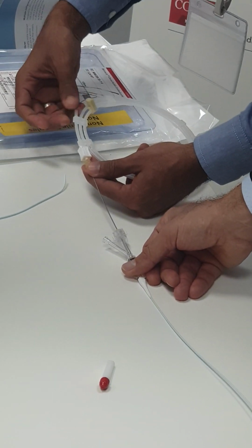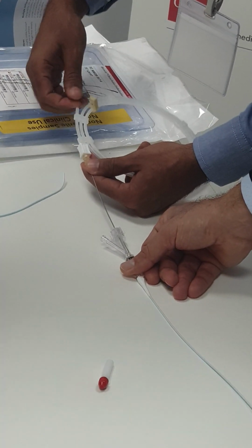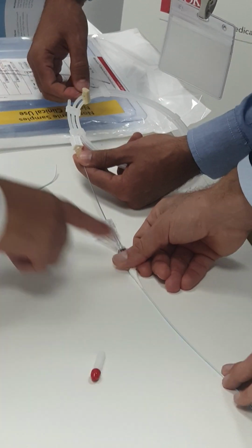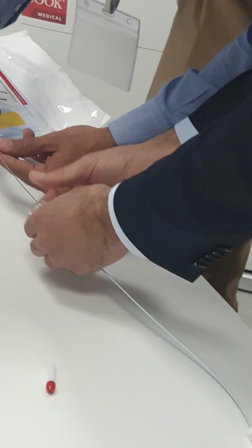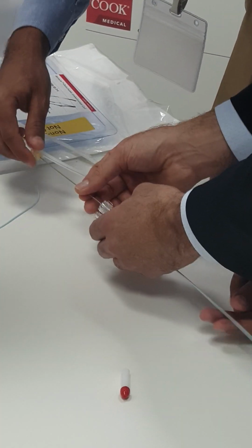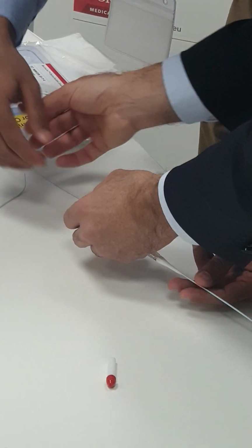And start pushing. Okay? Push. Once we show it inside, you pushed it, you can unlock or detach from this one. Now you can hold that. Push, keep the system straight and watch your catheter.